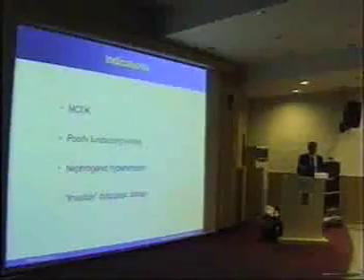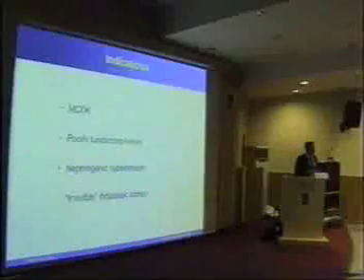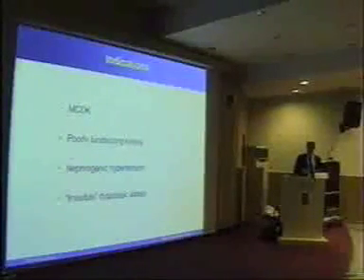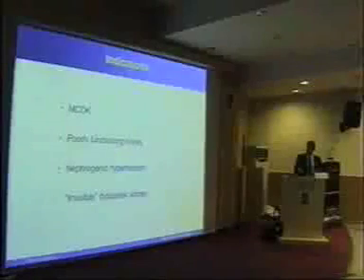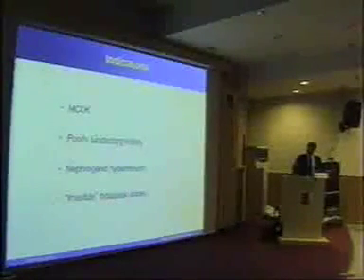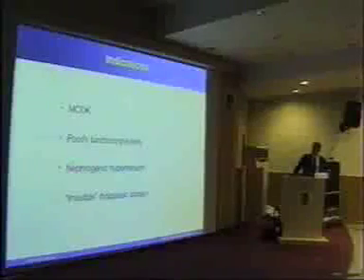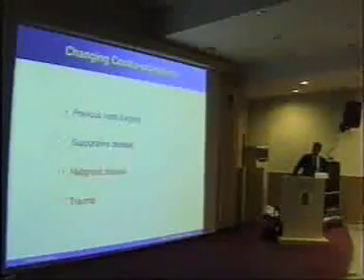And sometimes you get patients who are incontinent and they've got an absent kidney and you can't find out what's going on, and you laparoscope them and you find an ectopic kidney which you can remove. I've had 2 patients like this, and you do a diagnostic laparoscopy, you find where the kidney is, and you remove it because of its poor function, and they can be dry. Because the ectopic ureter that drains the kidney no longer has any urine going into it. You remove the kidney, you remove the urine, you remove the wetness.